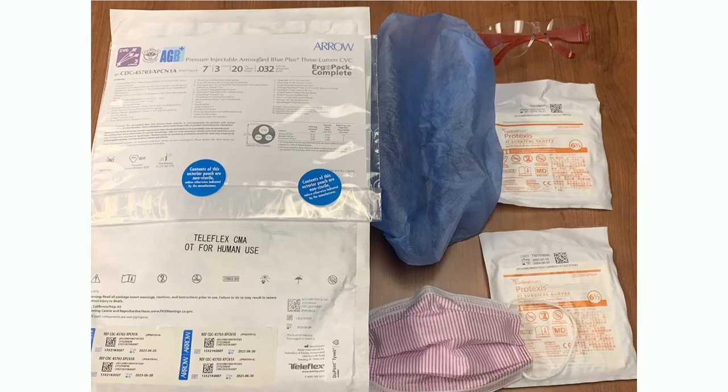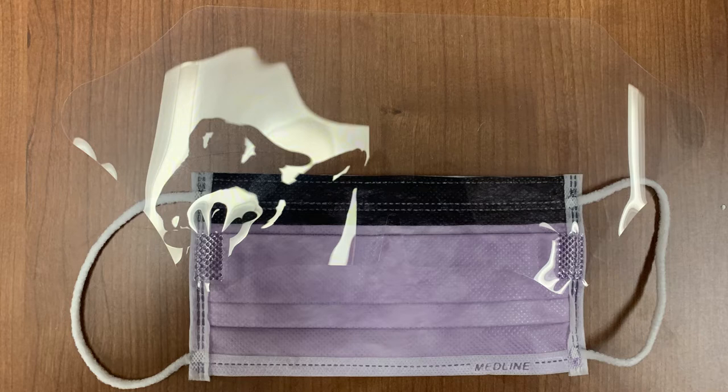For most procedures, you will need the aforementioned supplies, but if you are inserting a central venous catheter, the sterile gown is included in the kit. For all other kits, you will need to obtain a separate gown. If you do not have separate eye protection such as goggles, it is also appropriate to use a surgical mask with an attached eye shield.